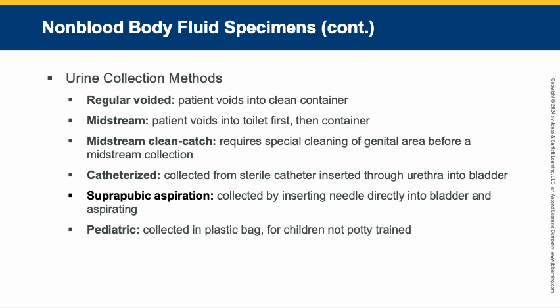And this initial flow helps flush any contaminants from their urinary tract. And then you bring the container into the urine flow. You collect a little bit of it, and then you take it out of the urine flow until the last of the urine flow is then voided into the toilet. So you're only catching the middle of the flow, and that's it.